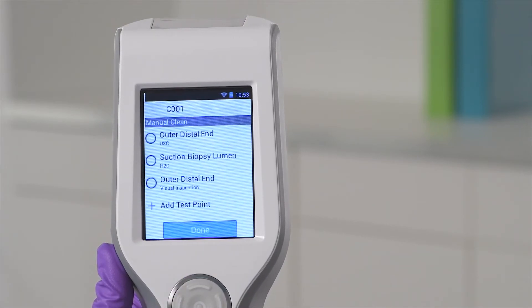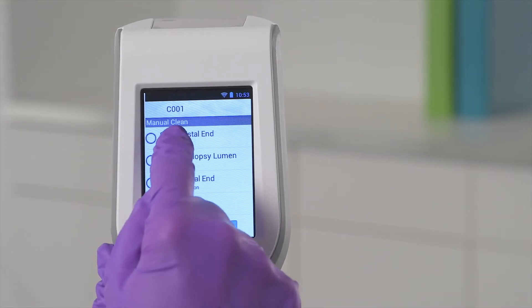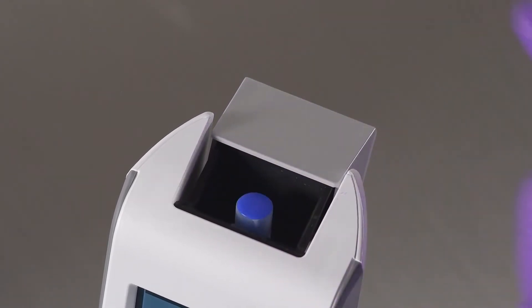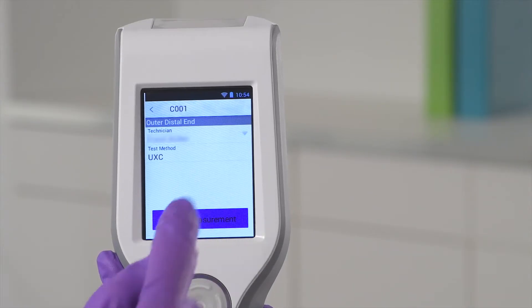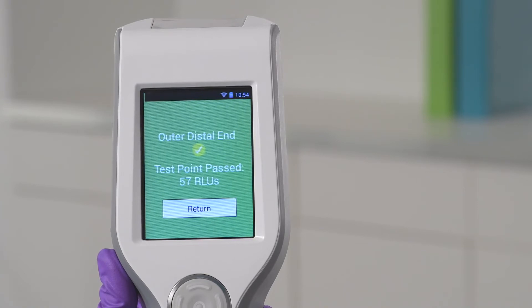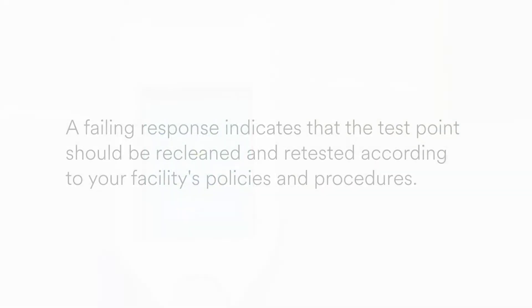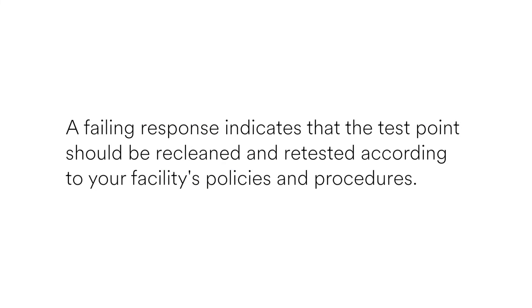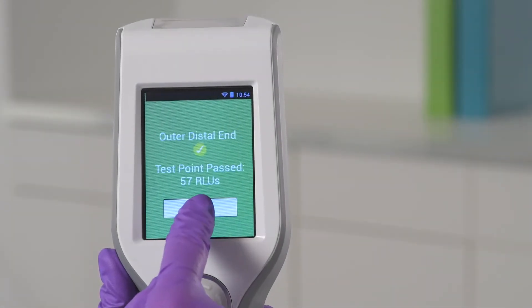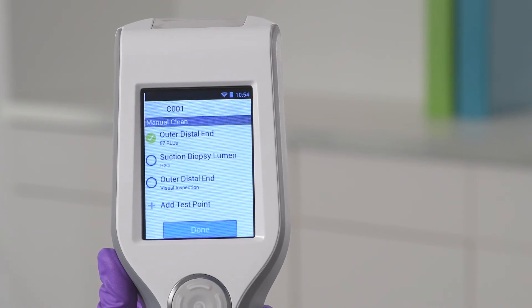Select a test point. For this example, we will select the outer distal end. Place your ATP test into the test chamber, close the chamber lid, and tap Begin Measurement. In 10 seconds or less, you'll see the result — a quantitative RLU value and a pass-fail response for the test point you were testing. A failing response indicates that the test point should be re-cleaned and re-tested according to your facility's policies and procedures. After your result is displayed, tap Return. Repeat this process until all test points have been tested. Tap Done when complete.